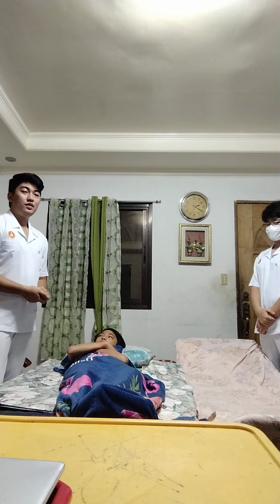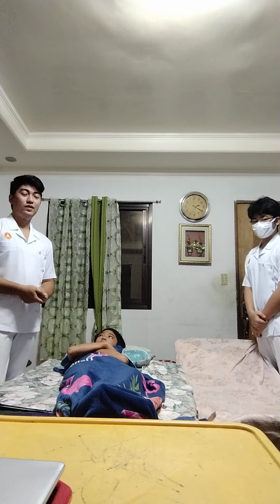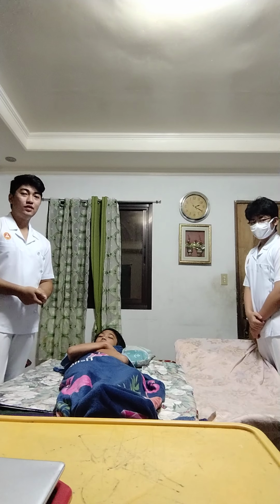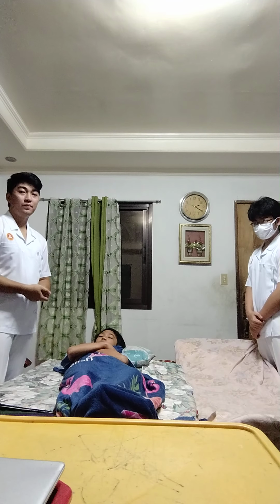Good day everyone. My name is Ivan Nicostales from BSN 1C, and today I'm going to transfer a patient from the bed to a stretcher. So first, let's assemble the equipment.